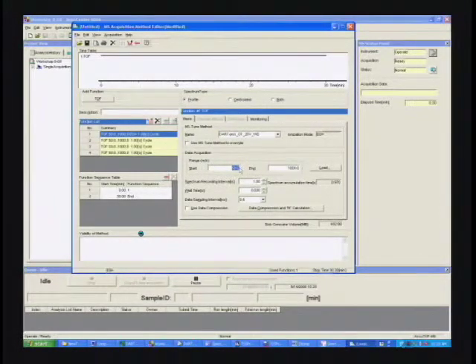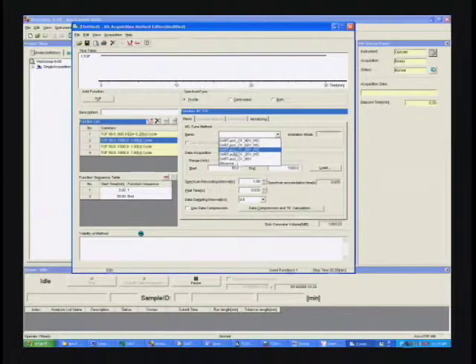We'll set our start and stop masses, and at the Department of Forensic Science we run from 66 up to 600 for our mass range. And then we're going to set a recording interval at 0.25 seconds, which will allow us to record a spectrum in each function every second. So we'll end up with 4 different functions, 4 different TICs to be able to evaluate the data at 4 different orifice voltages.